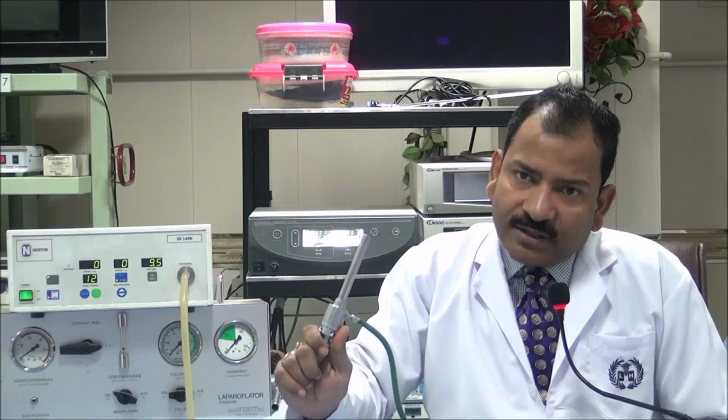Again the question. Preset pressure is 12, actual pressure is 6, flow rate is 1 liter per minute, total amount of gas used is 8 liters, in a 22-year-old nulliparous woman. If you are doing it with a Veress needle and there is no abdominal distension, then where has the gas gone? From the source of the Vena cava. Okay, you are saying that it is leaking somewhere in the chest. Okay. Then? Vena cava. This is the Vena cava. Yes, he is correct. Any other answer?